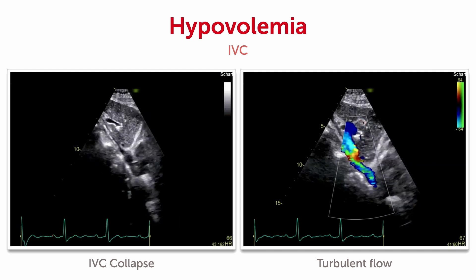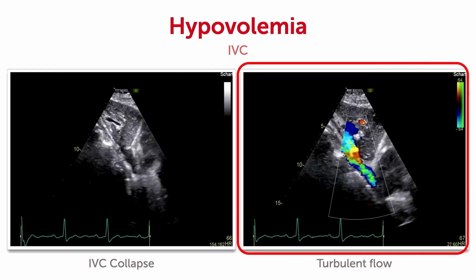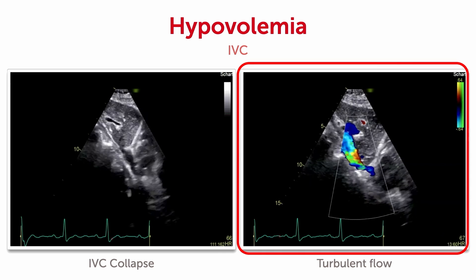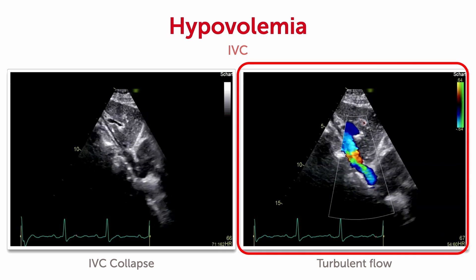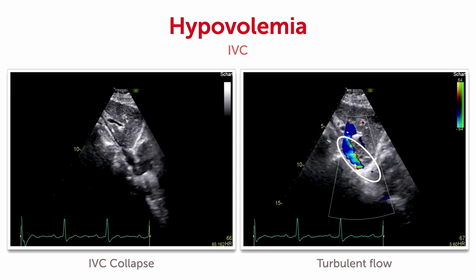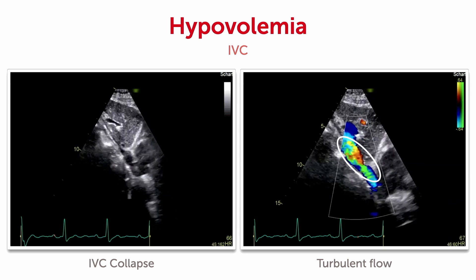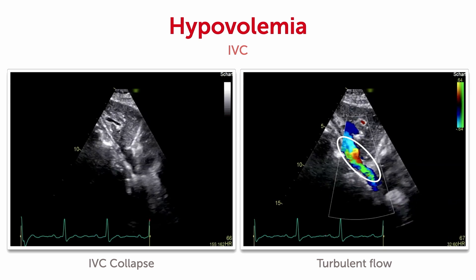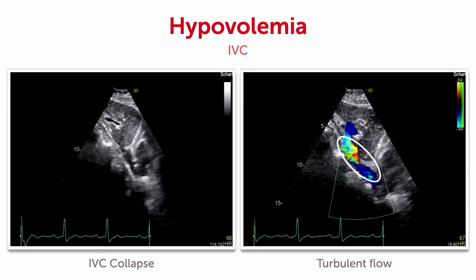Why? Because in this situation it not only helps you to localize the IVC, but you will frequently see high velocity turbulent flow, as you can see right here on the right hand side. So if you see this finding, it points to hypovolemia, no matter the cause.